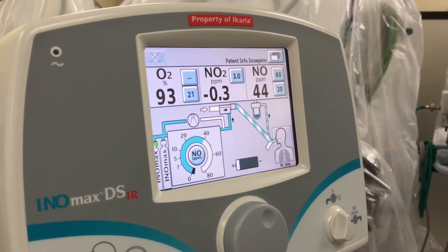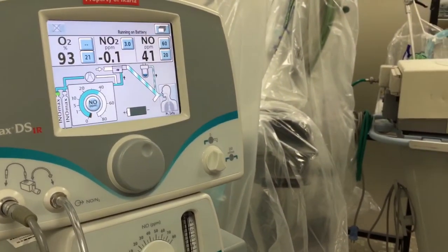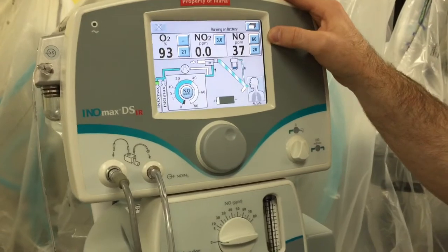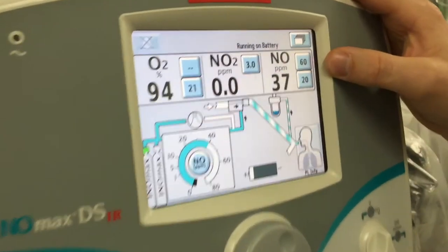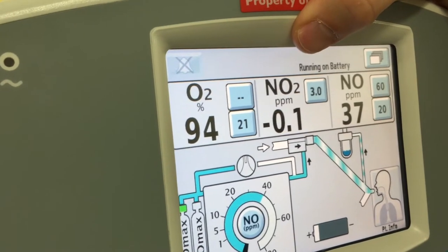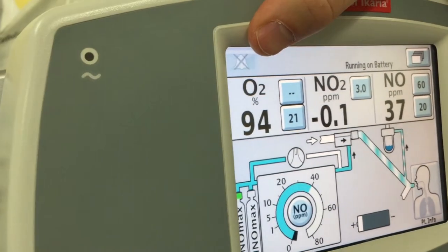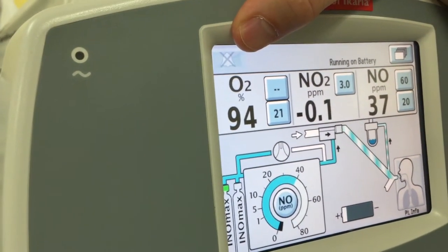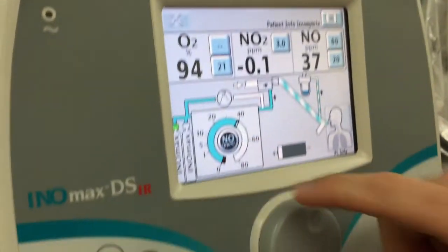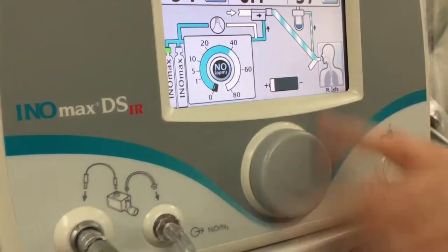According to the pre-use checkout card, the performance test concludes when NO reaches 35 to 45 parts per million — we're already there. NO2 has to be less than 1.5 parts per million — we're already there. Oxygen has to be 95% plus or minus 3% — we're already there. So we're done with that test. Now set the dosing to zero.